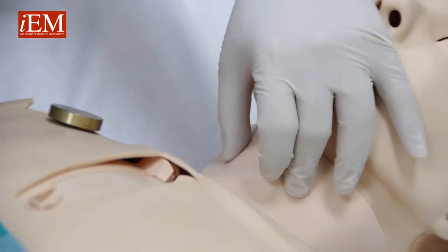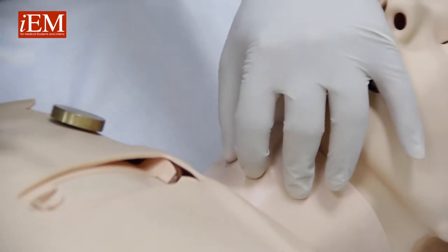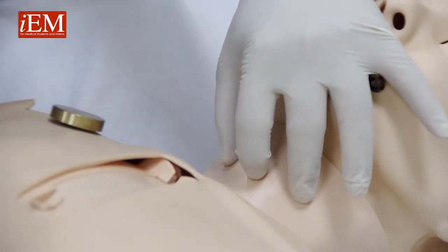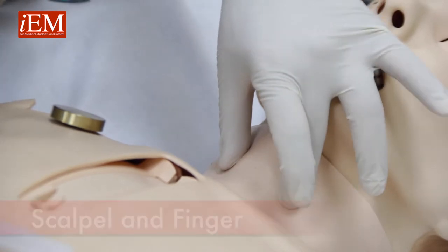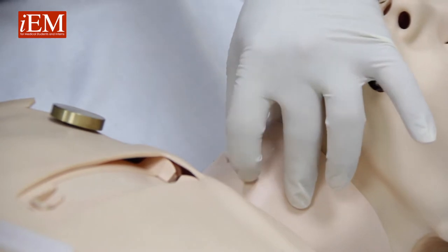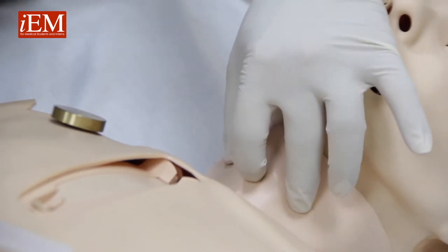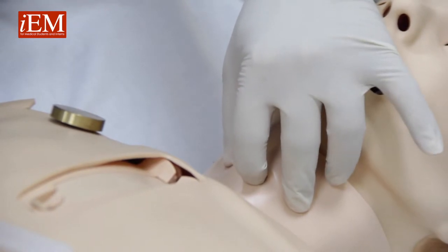Now we're going to show you how to do a surgical airway — a surgical cricothyroidotomy — using just your finger and a scalpel. You locate the trachea between your thumb and your third finger, and your index finger locates the cricothyroid membrane, which is right here underneath my index finger.